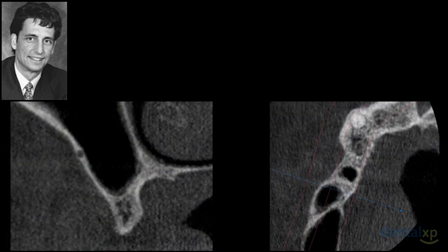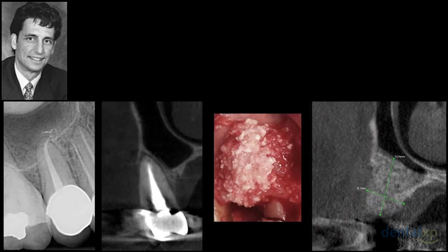We also preoperatively see things such as vessels, and that can impact our lateral wall position, and we see septa. As you know, septa can really challenge your reflection of that Schneiderian membrane, and that can make a difference between if you've only done a few sinus lifts, if it's something you want somebody else to do, or if it's something you want to tackle. It certainly increases the complexity of the case, and it's something that you would like to know before you initiate treatment.